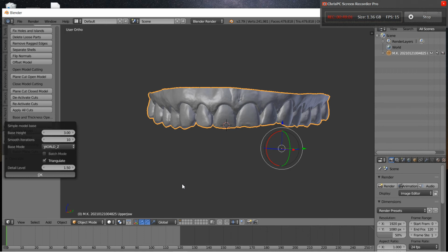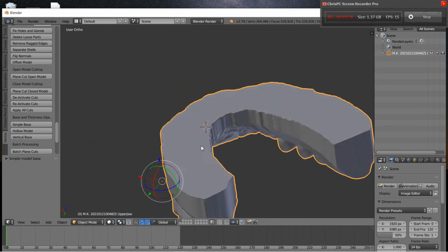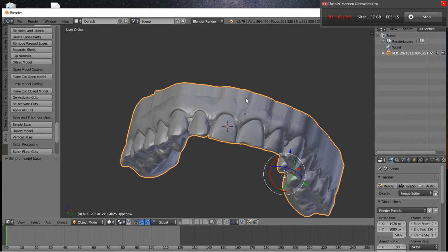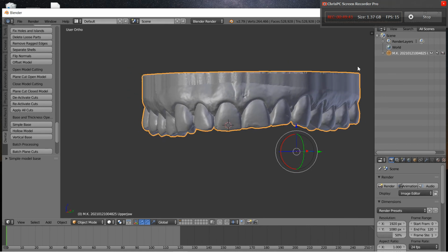The nice thing about this software is you can install it just about on any scanner that you have. It requires very limited space. I usually install this on my backup drive, so I have a C drive and a D drive. And what I actually do with this is I can design my night guards, or I can print my models directly from the chair. So you can see right here, I now have a filled in model that's actually exportable. If we went to File, Export, STL, we could actually 3D print this model for the cost of about $1.50 and one of the 3D printers we talked about.